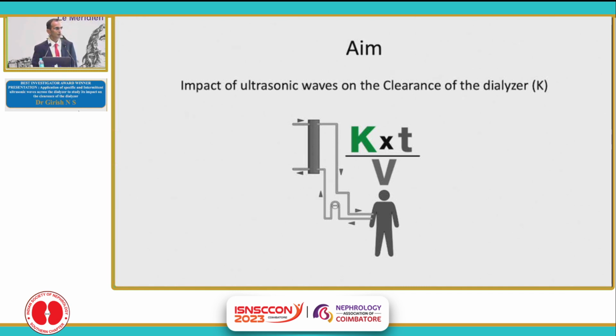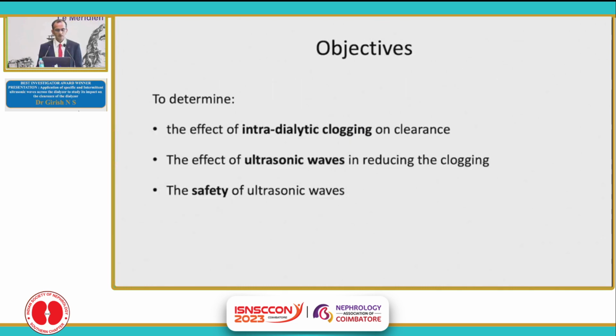We all know about Kt/V. K is the dialyzer clearance, which is essentially the urea clearance, and Kt/V is a measure of adequacy. So the objectives of our study were to see the effect of intradialytic clogging on clearance, and to see the effect of ultrasonic waves in reducing this clogging phenomenon, obviously keeping in mind the safety of these waves whilst doing an in vivo study, because that has never been done before.